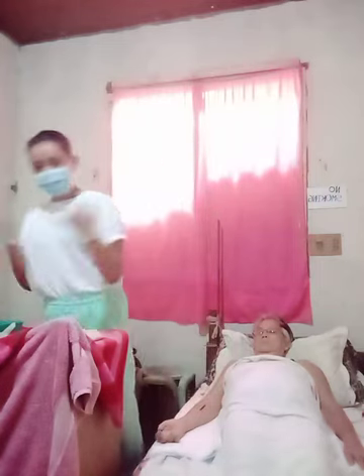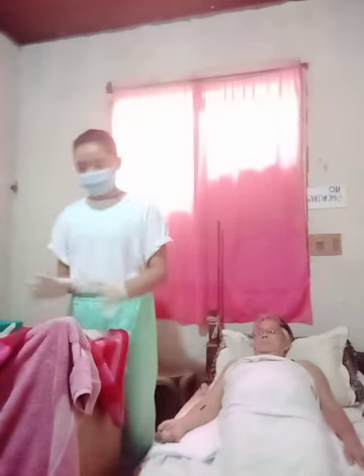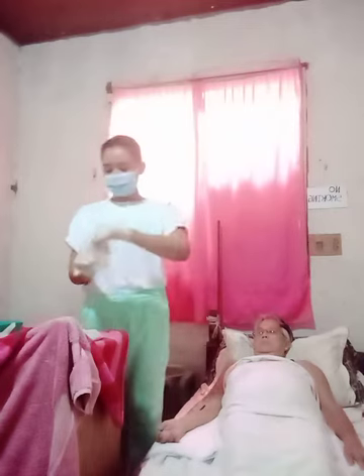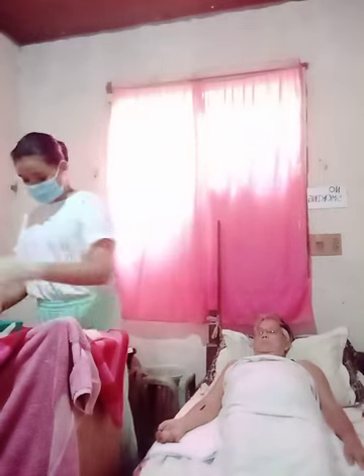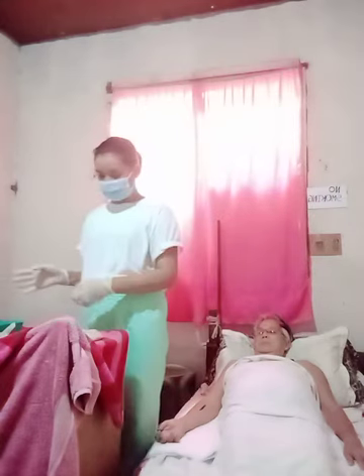This is sterile, and this is sterile in here. These are the sterile balls. I'm going to open them, then get my picking forceps.